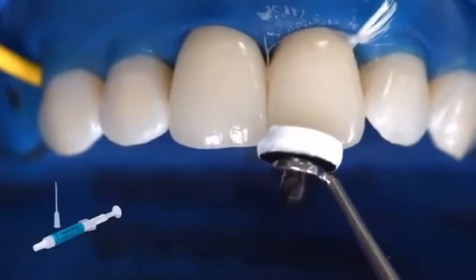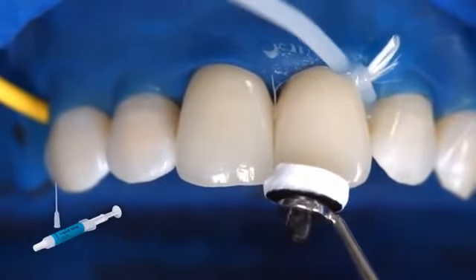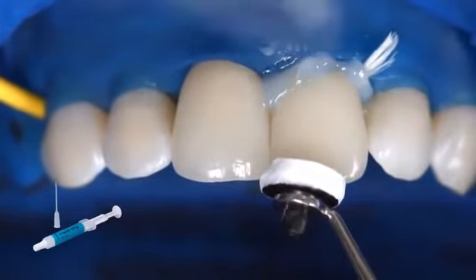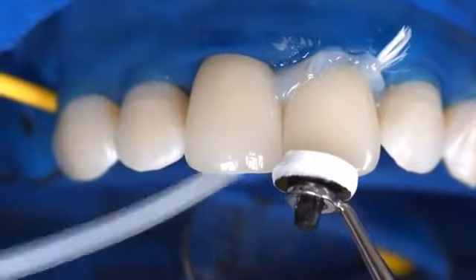Like all other composite resins, Variolink Esthetic LC is subject to oxygen inhibition. To counteract this effect, cover the restoration margins with glycerin gel or air block immediately after having removed the excess cement. Liquid Strip is an ideal product for this purpose.